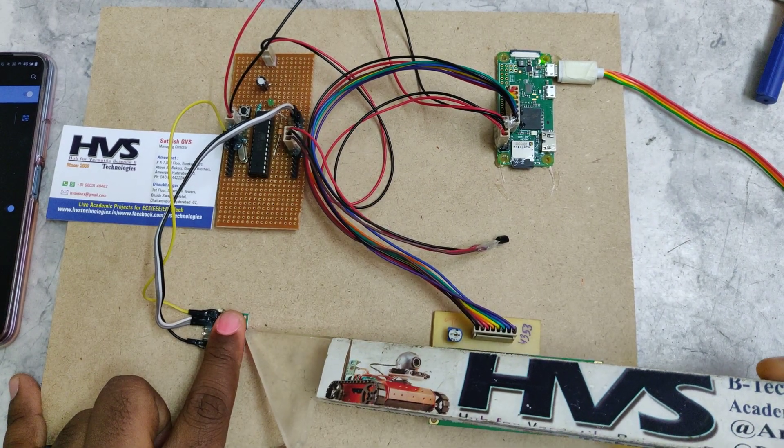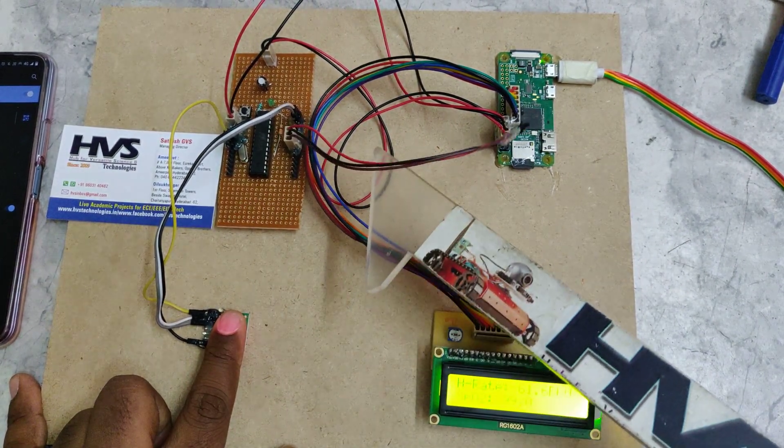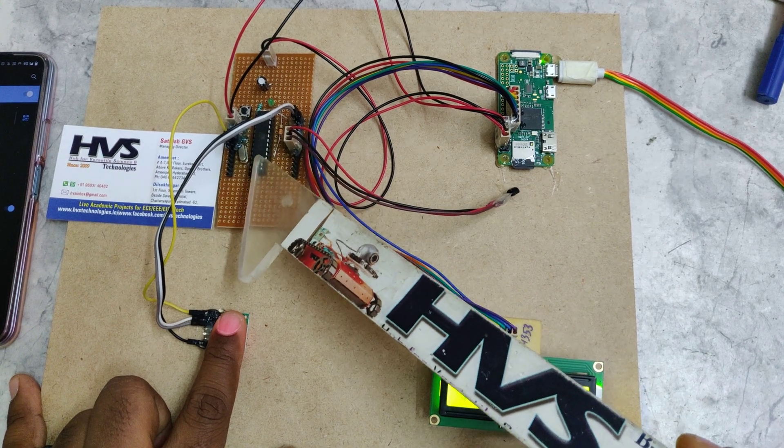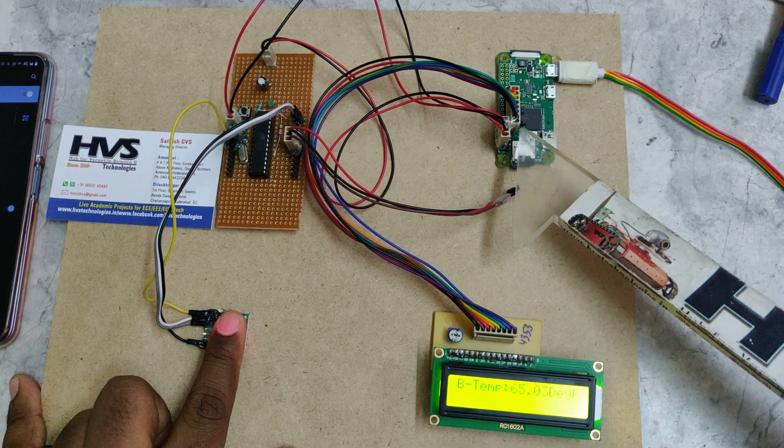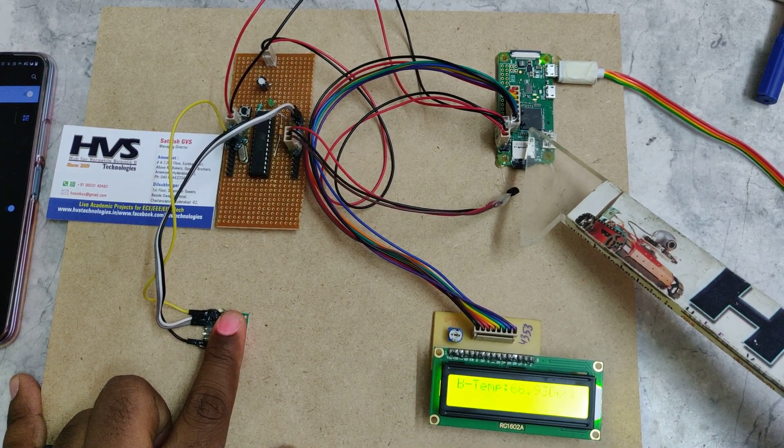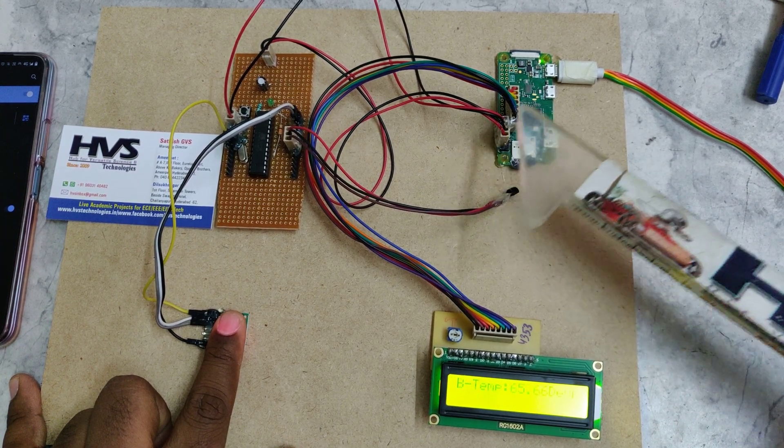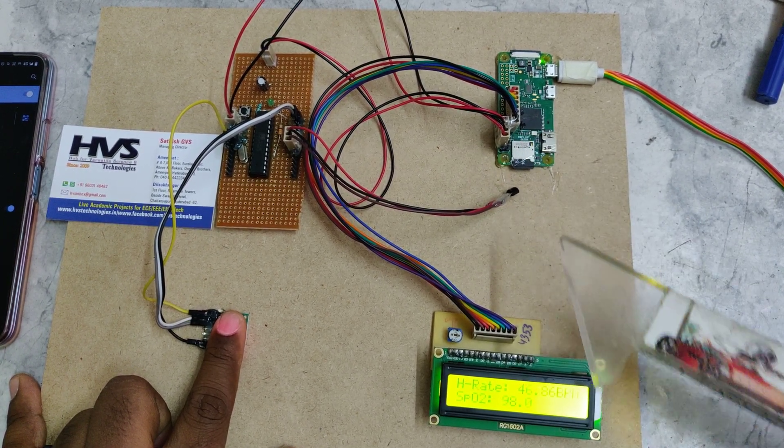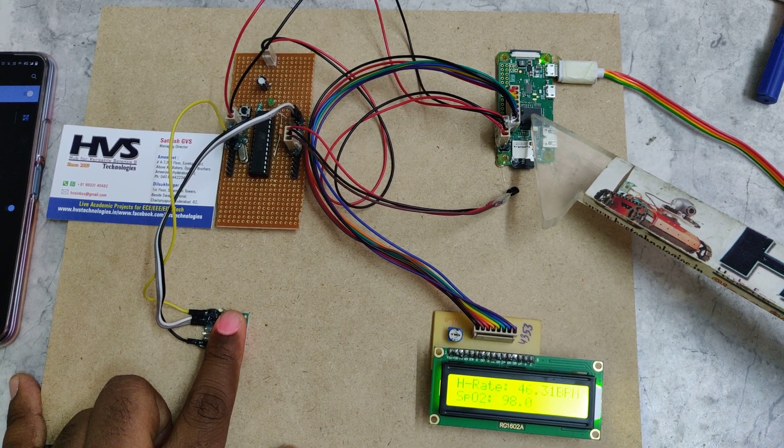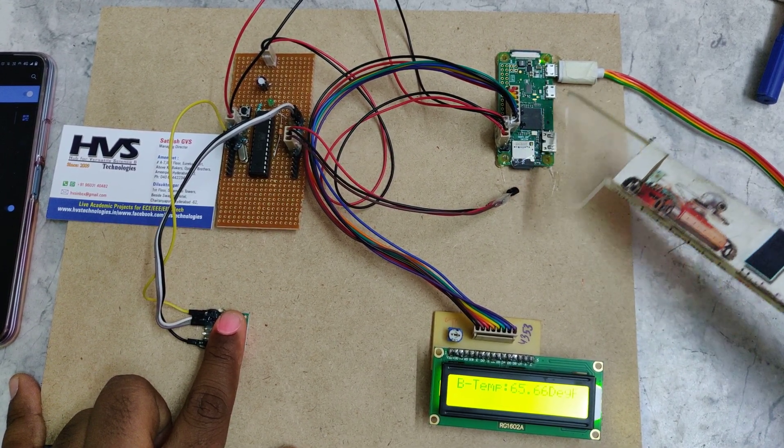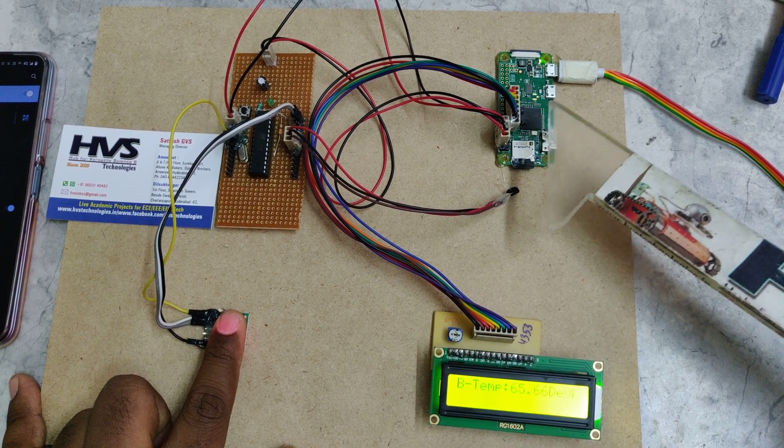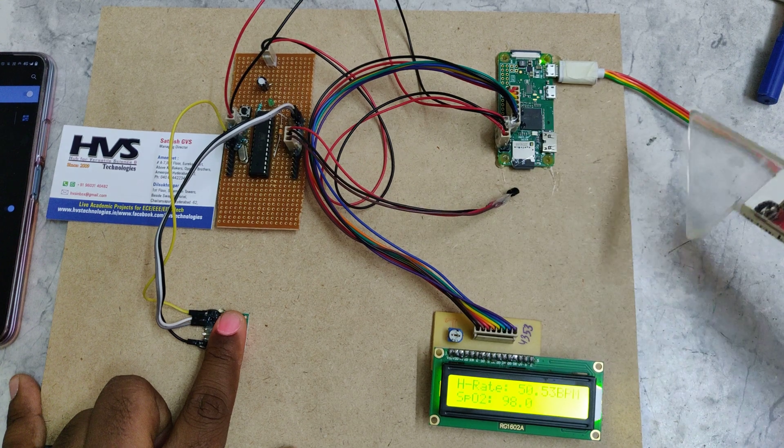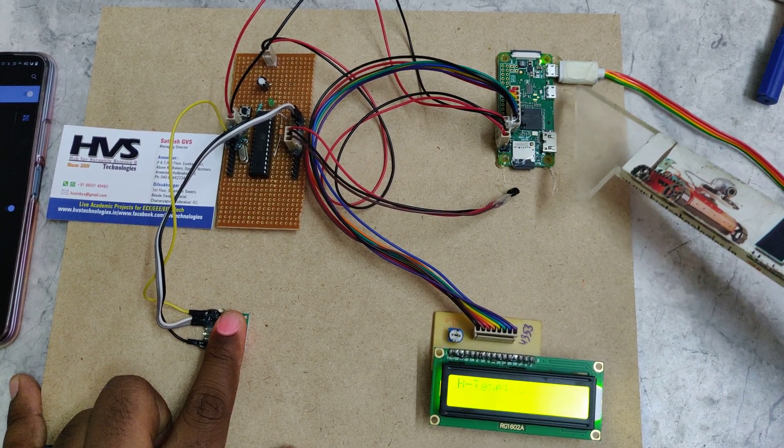The TX/RX of the ATmega controller pins are given to the TX/RX of Raspberry Pi Zero W. From here we are going to decode the data and the data will be displayed on the LCD with the help of Raspberry Pi Zero only.